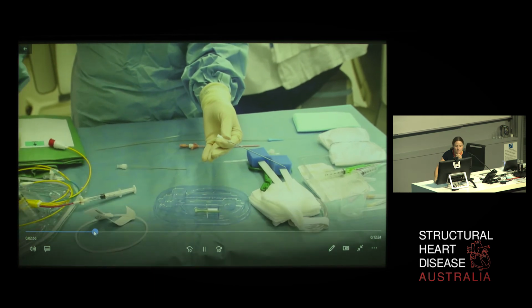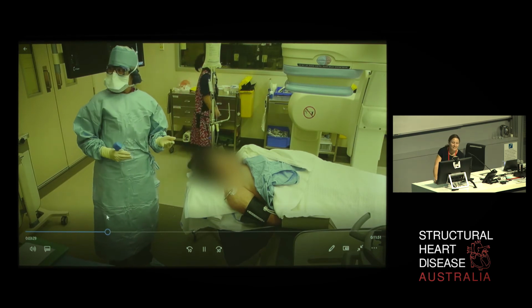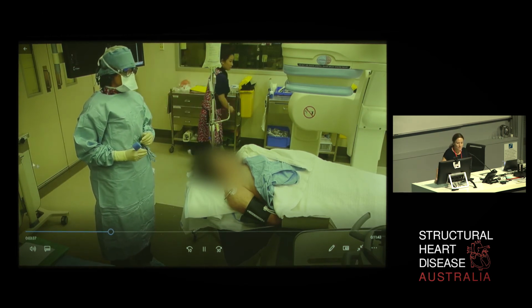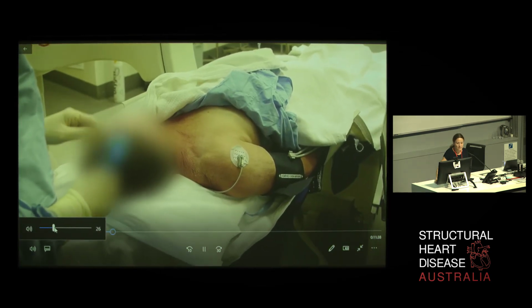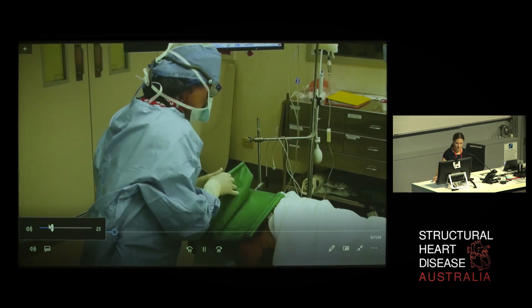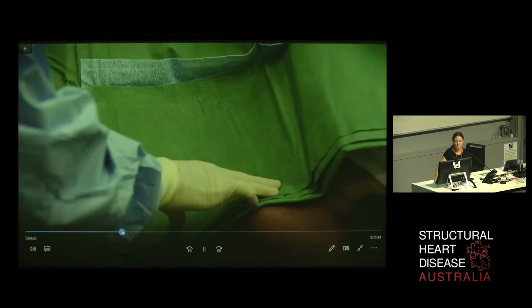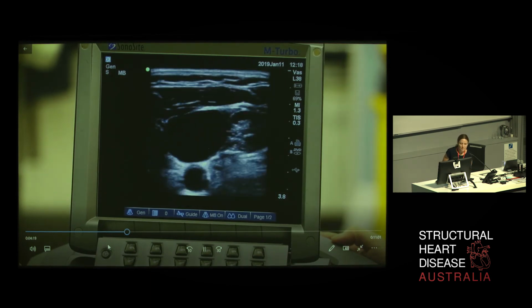We're flushing. It's a lot of flushing. A lot of flushing. We have the patient who has the head. But the only thing I do want to say here, note that the patient is lying up straight with the head rotated to the left, and tubing running around the back of the head so that the neck is exposed. But try not to get them to turn their whole body, just a rotation of the head. Open it up across your face so that you feel you're not too covered. But feel free to close your eyes too. Can you see the picture there well on the ultrasound? Fantastic. Use ultrasound guided puncture.